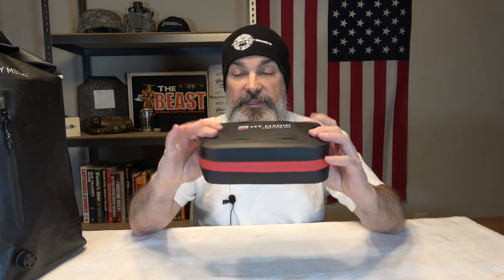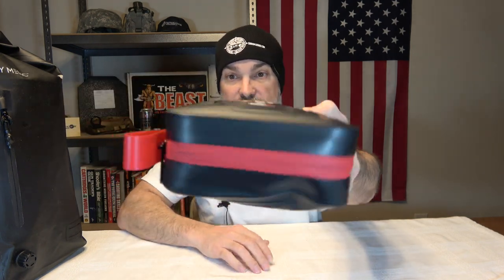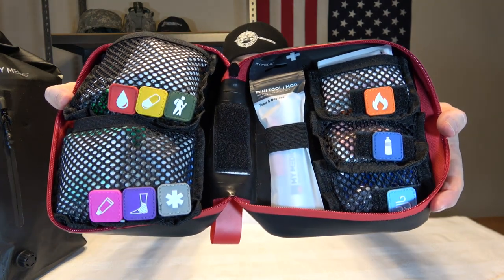Let's go ahead and break down the first aid kit first. One of the things about it: it is kind of a rubber material, and it has two flaps that go across the zipper, which would make this semi-permeable to moisture and water. You're not going to have as big a problem with moisture getting in as you would with an exposed zipper. And one thing I really like about this is the organization — that is awesome.